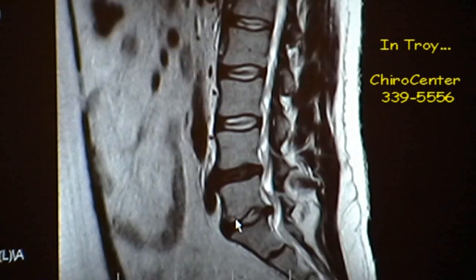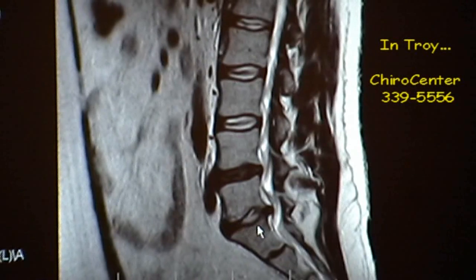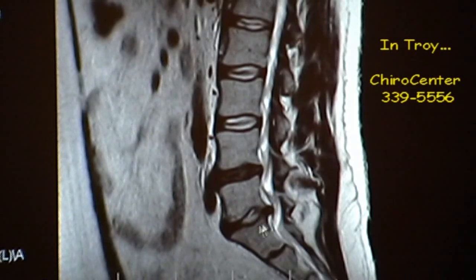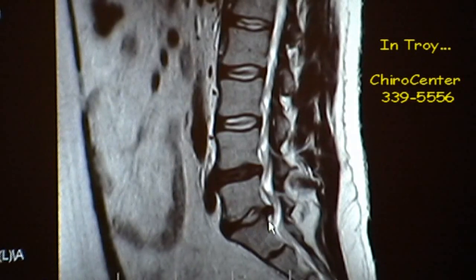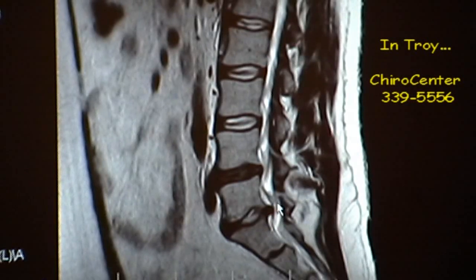You will see here on this very bottom disc that it has a huge bulge that's coming out from under the vertebrae, and in this particular individual's case it's actually applying pressure directly to the cord. You can see how the bulge is actually indenting the spinal cord, and this is in all likelihood the cause of this individual's neuropathic pain.